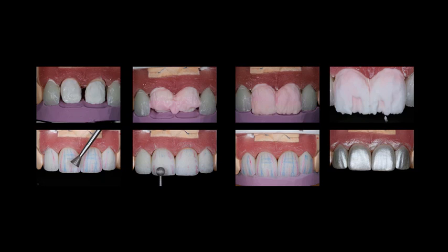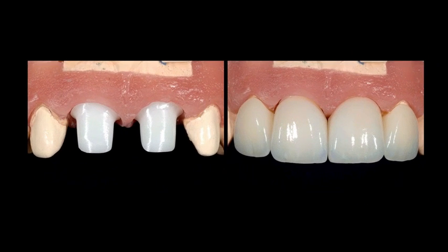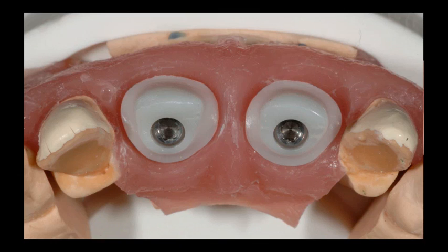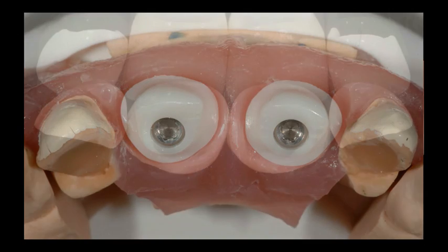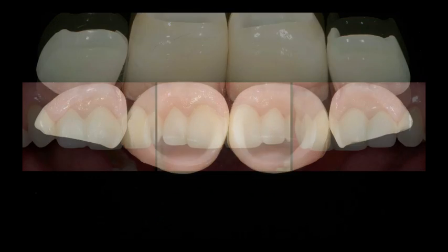The case was completed prosthetically by Harold Heindel, who's a master dental ceramist in Seattle, Washington. And here are the abutments and the crowns and the veneers in place. And just another view of the abutments. And an overall view of the case. So it's beautiful ceramic work. I'm really happy to have the opportunity to work with Harold on quite a few cases.